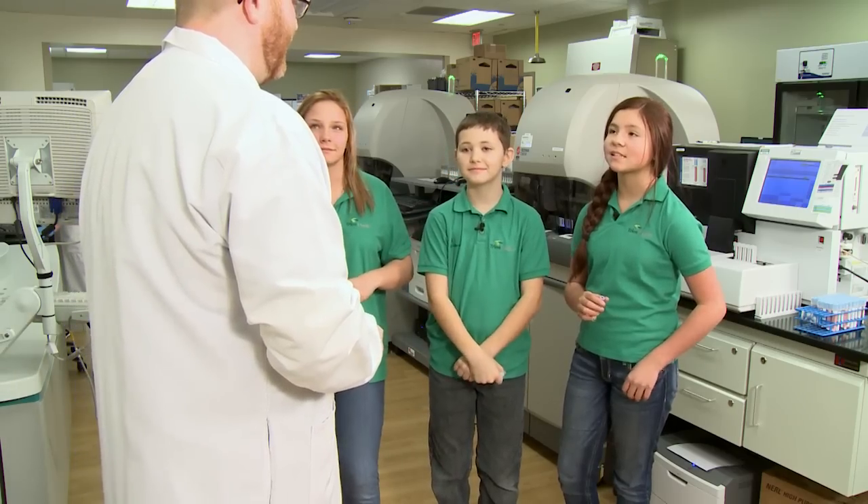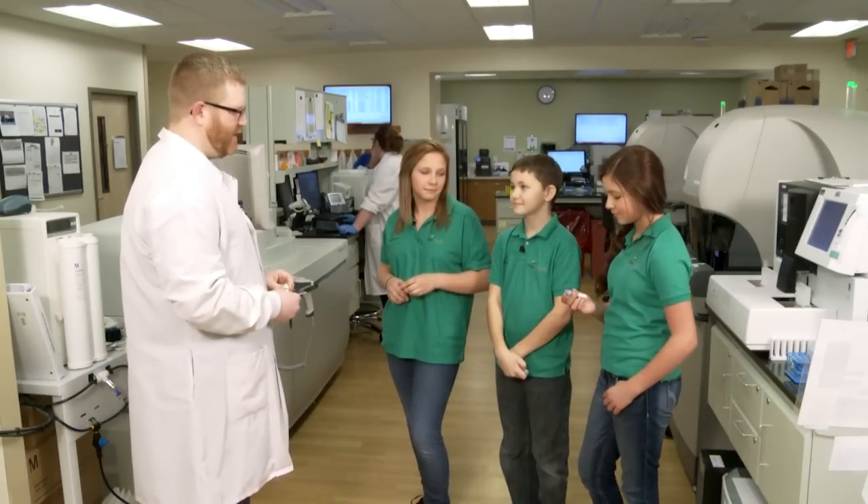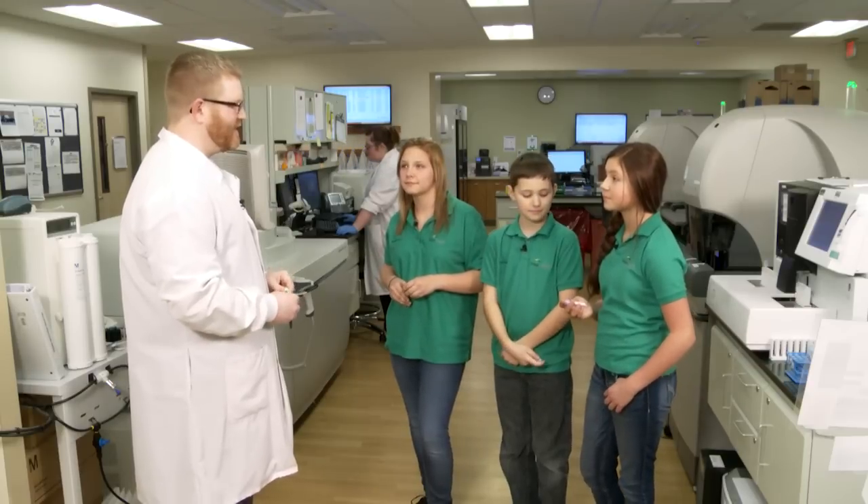What are your most common tests? That's a great question. We do a lot of different tests. One of our most common ones is run on that purple tube — it's called the CBC. That's where we count the different cells in your body. Pretty much every patient here will have one of those every day, and outpatients who just come and get their blood drawn for their doctor will usually have one as well.